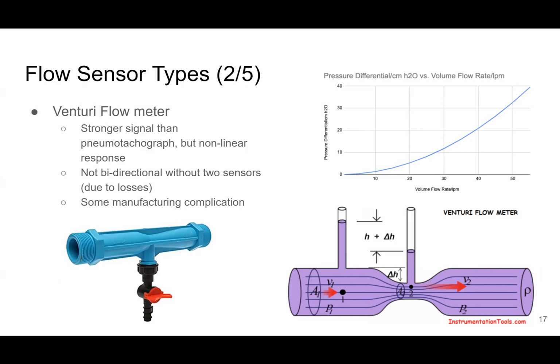And then as well, this isn't an issue as much in the current prototype, but it's not bidirectional, which was more of an issue before. So it's mainly that nonlinearity of scaling. And basically the first time we implemented this, the flow rates on exhale tend to be lower than the flow rates on inhale. And so we were kind of systematically underestimating the exhale flow. And that again is something that's probably addressable with a little bit more design effort, maybe differently sized.